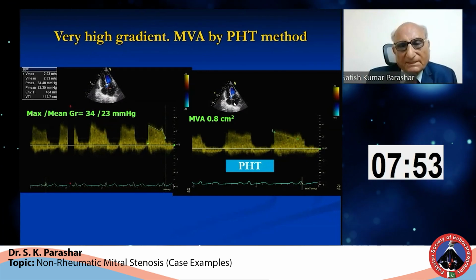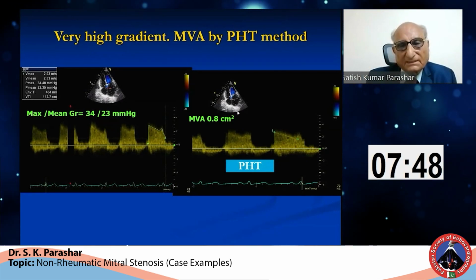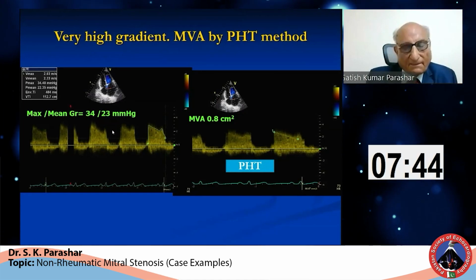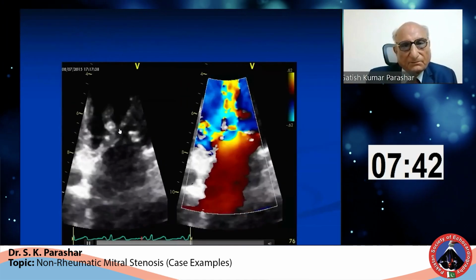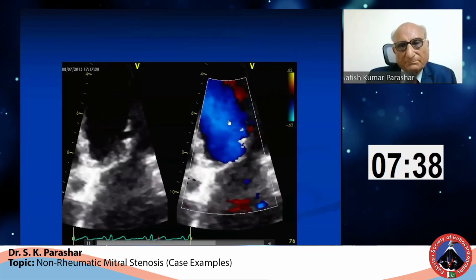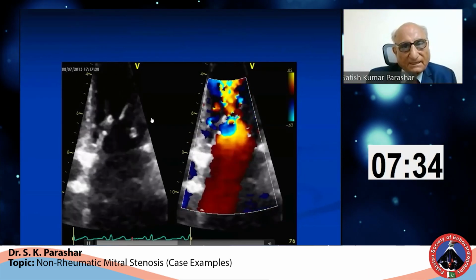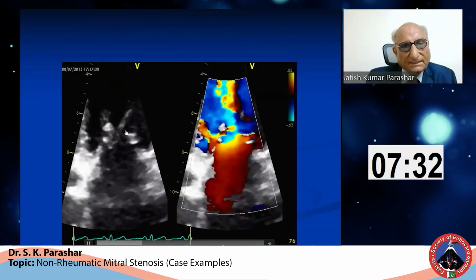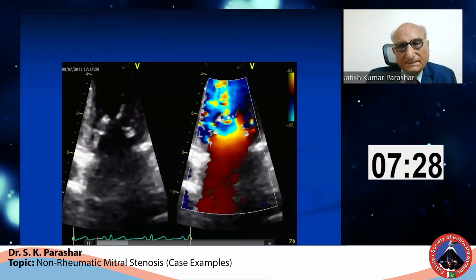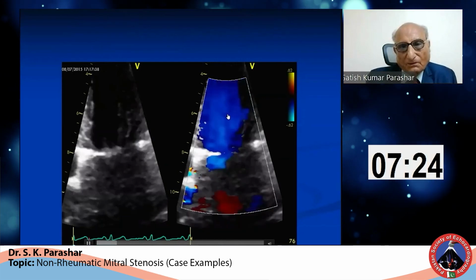So that means this continuous wave Doppler was interrogating all the structures, including the subvalvular apparatus, and this produced this finding. And when we did color flow mapping, you see the obstruction is much beyond the mitral valve area, in the region of subvalvular fibrosis. And you see here the thickening. Although it was a rheumatic case, subvalvular stenosis should also be well recognized in these cases.